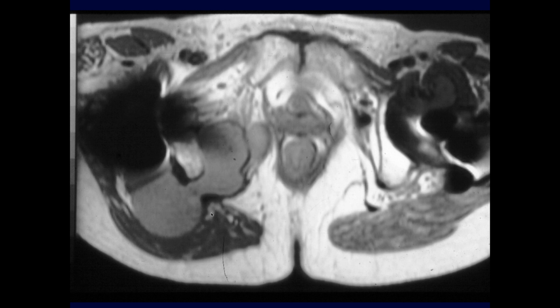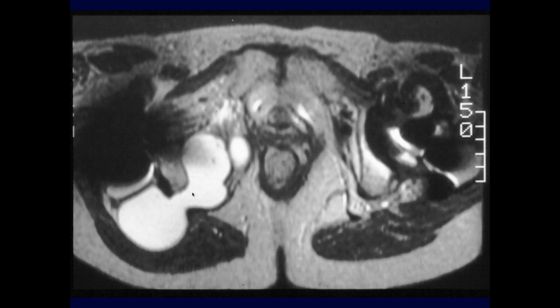I think we're seeing a defect. Looks like there's a lot of fluid. There's bilateral hip replacements, but there's a lot of fluid along the right side, kind of adjacent and extending through near the gluteus musculature. And is it multiseptated somewhat?